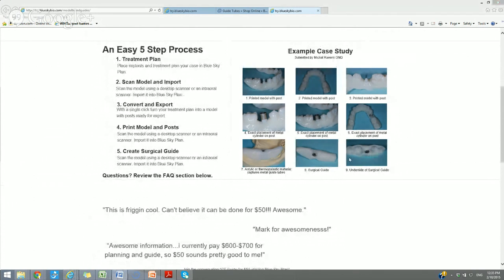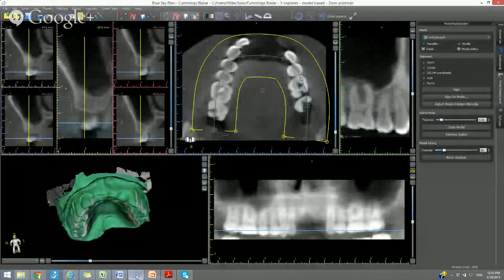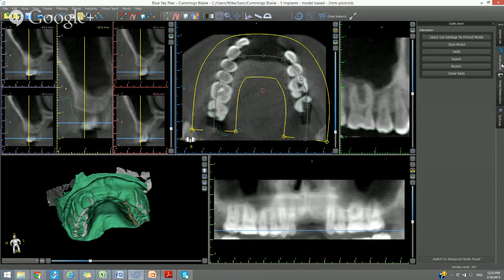So the advantages are you could use the non-FDA material, the non-FDA printer. Everything is clear, everything is there to see, and also in tighter spaces, it's often advantageous. The process flow in terms of creating the model with the posts.